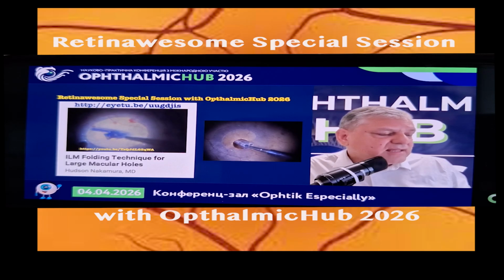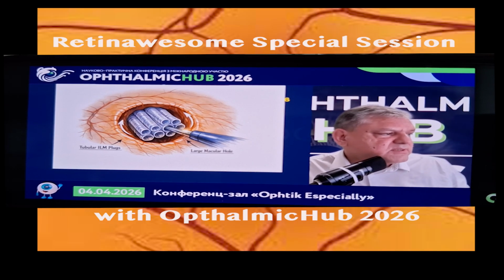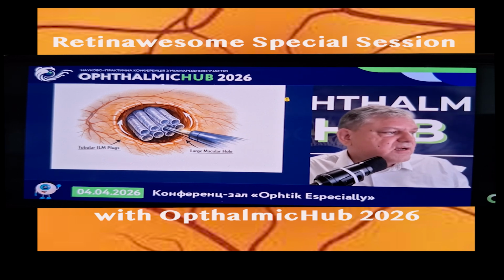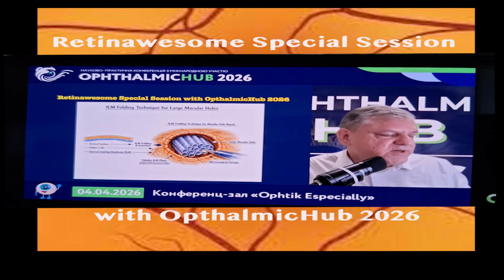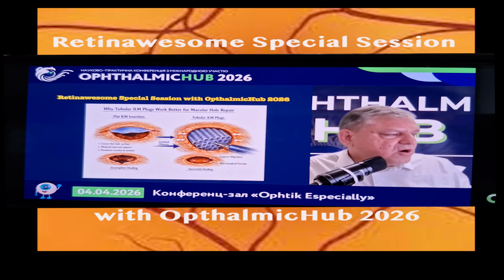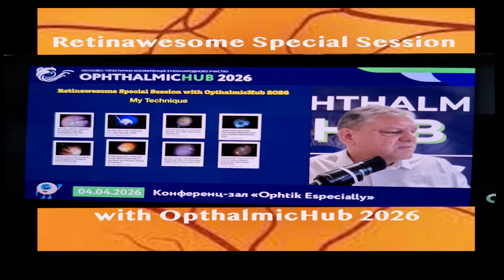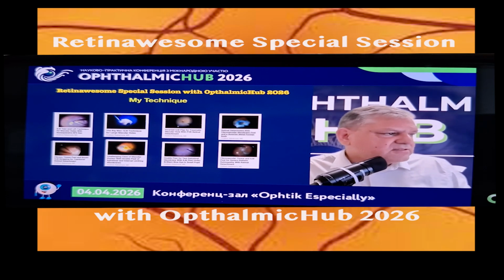After some months, people started stuffing, but not in this tubular way that I do. People started calling this a stuffing technique, but this is not what people used to do until today. This is the ILM folding technique, the way I first made it.